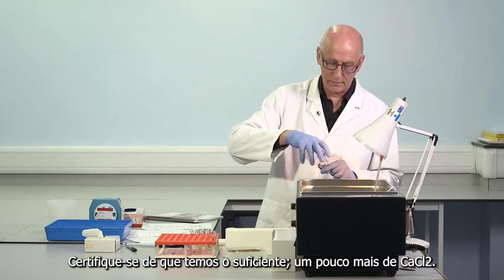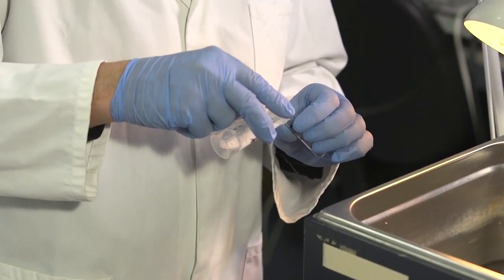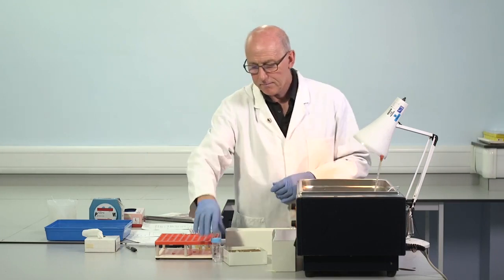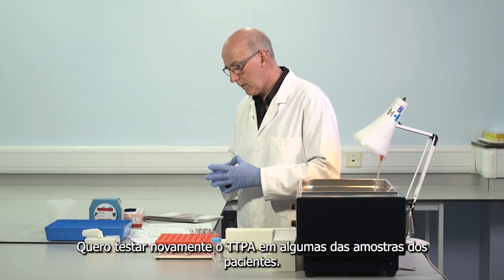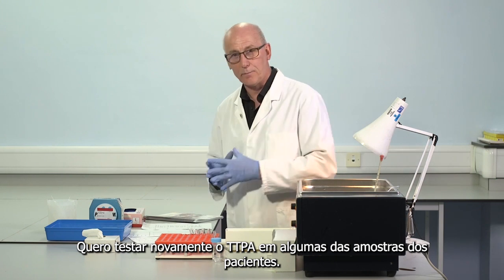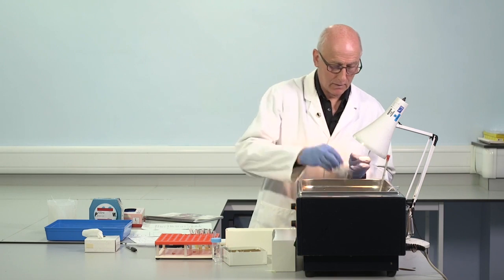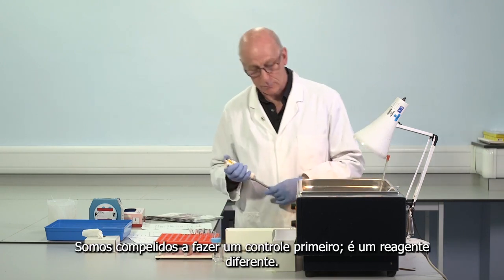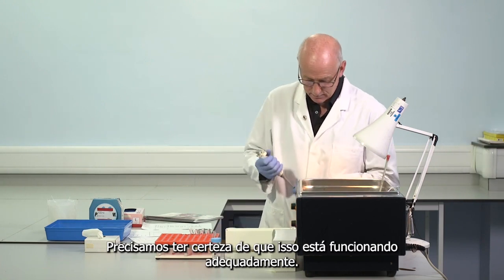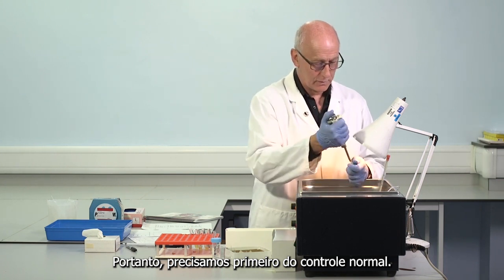Make sure we've got enough, a little bit more calcium chloride. So I want to retest APTT on some of the patient samples. Let's see what we get. We are compelled to do a control first. It's a different reagent. We need to be sure that this is working appropriately. So we need normal control first.